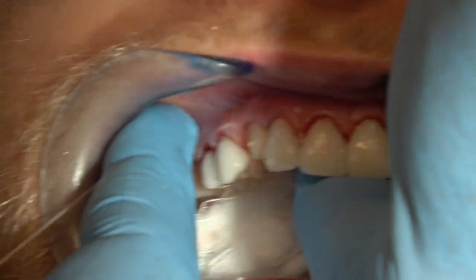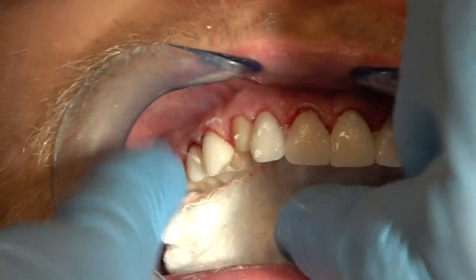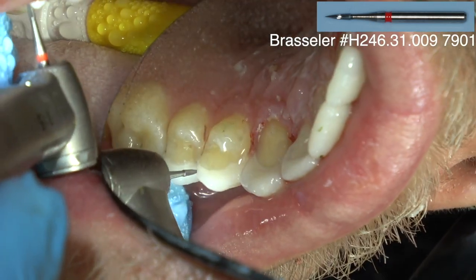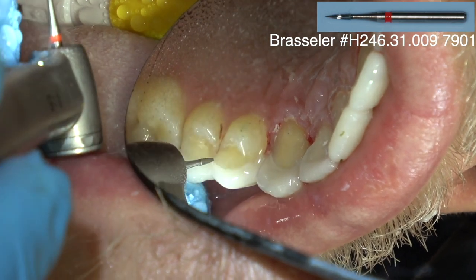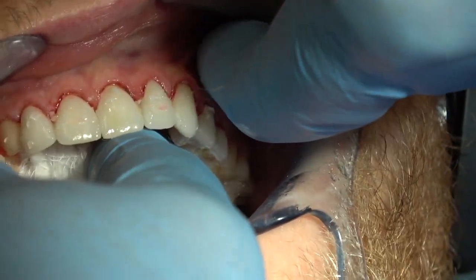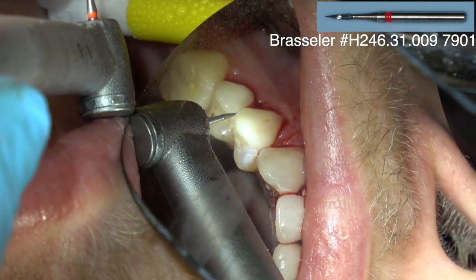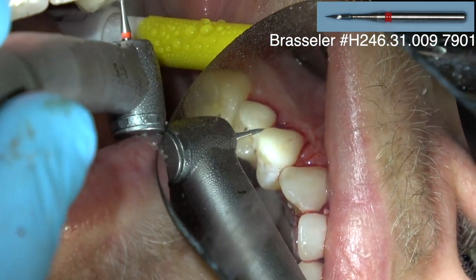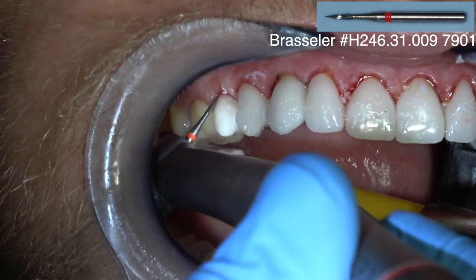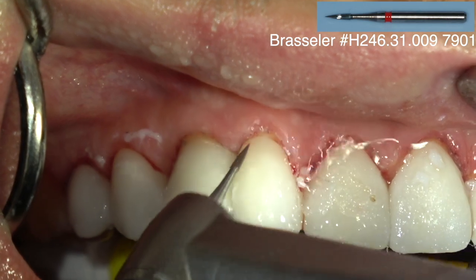And what if you can't floss between some veneers? Sometimes that's going to happen. You're going to come back with this 12-fluted carbide burr and just polish in between the restorations. It's normally the bicuspids where you haven't broken the contact, and it's not a big deal. You just polish between and remove that little bit of luting composite that's set up in the interproximal contact. Just light pressure. I'm going to cure these 60 seconds on both sides after we've initially removed the excess composite.